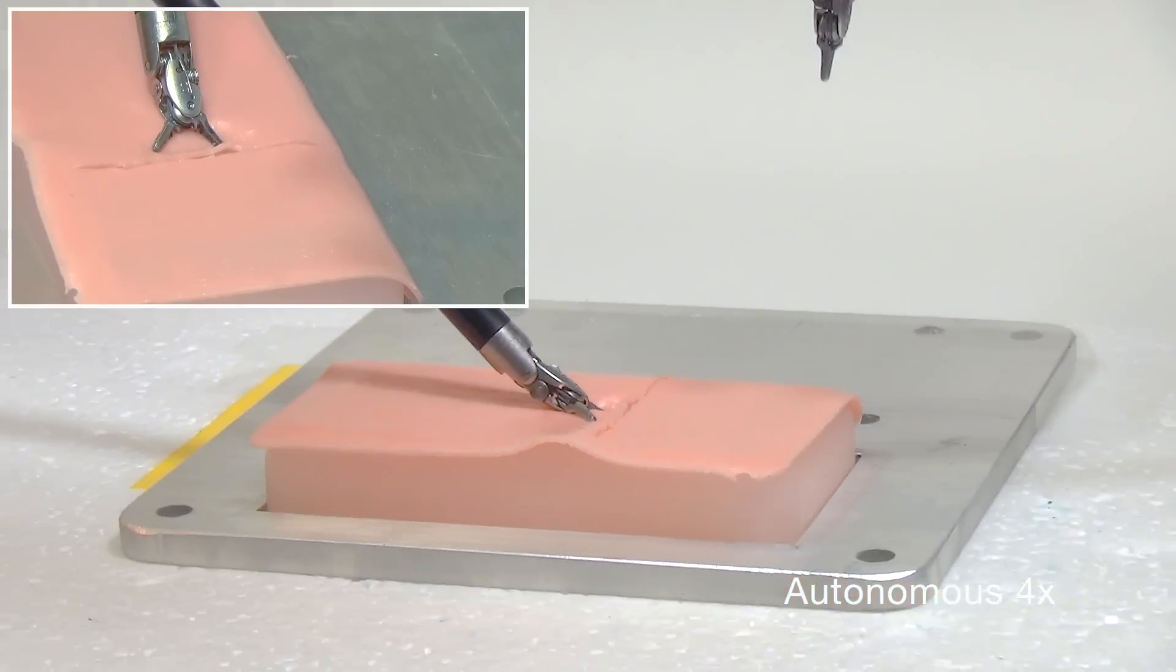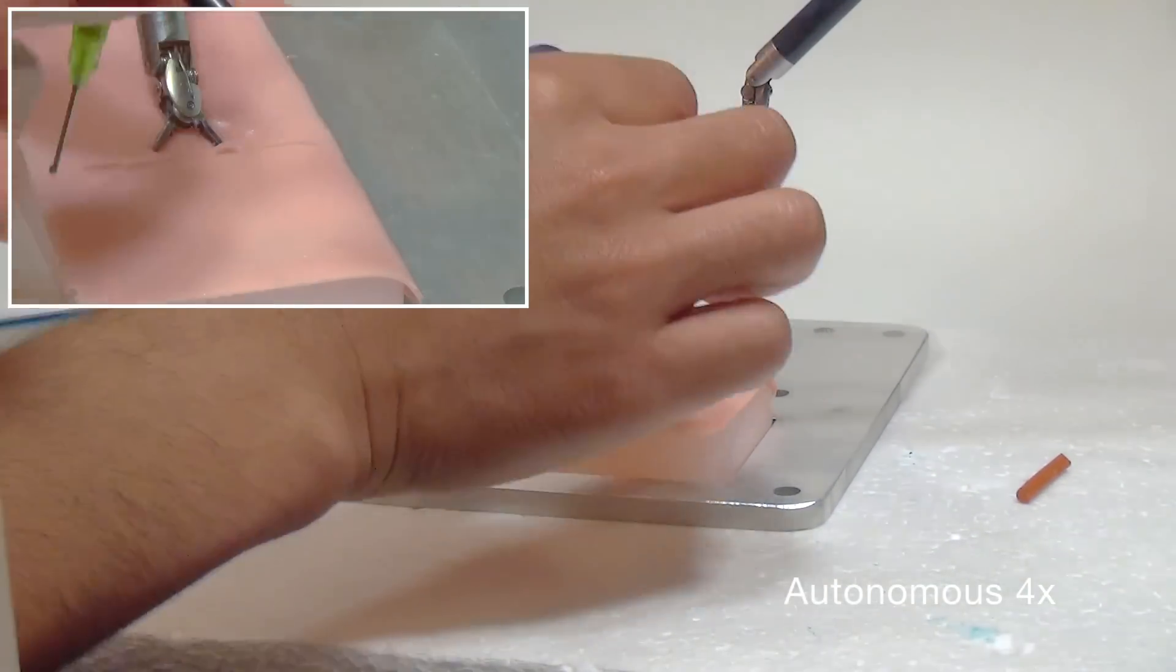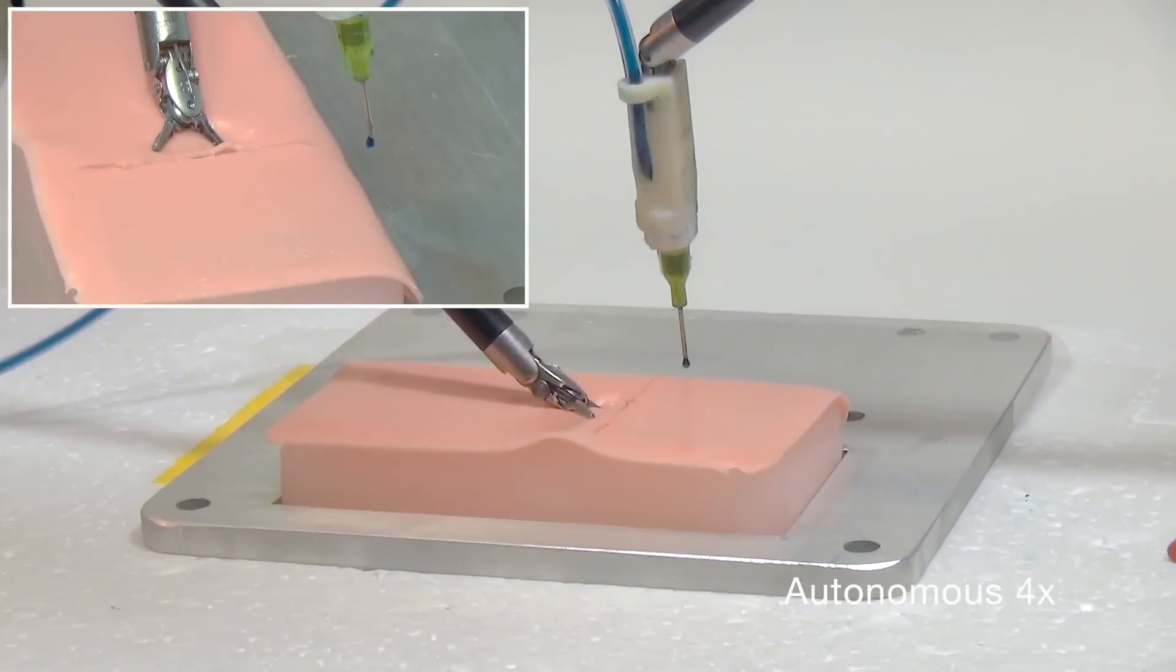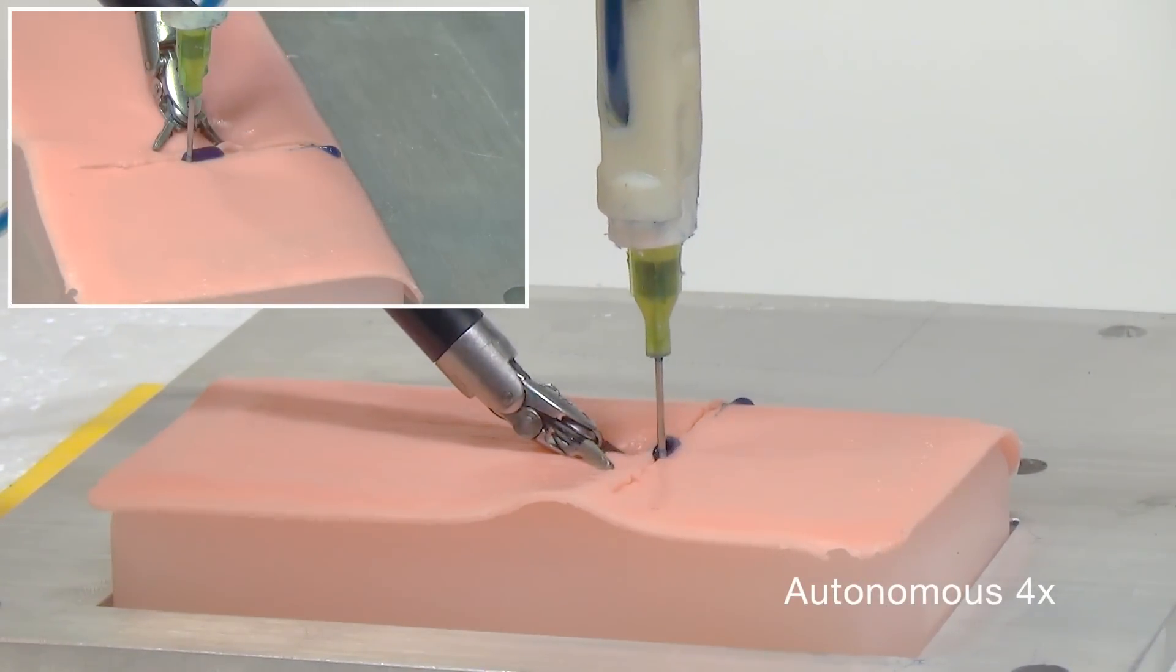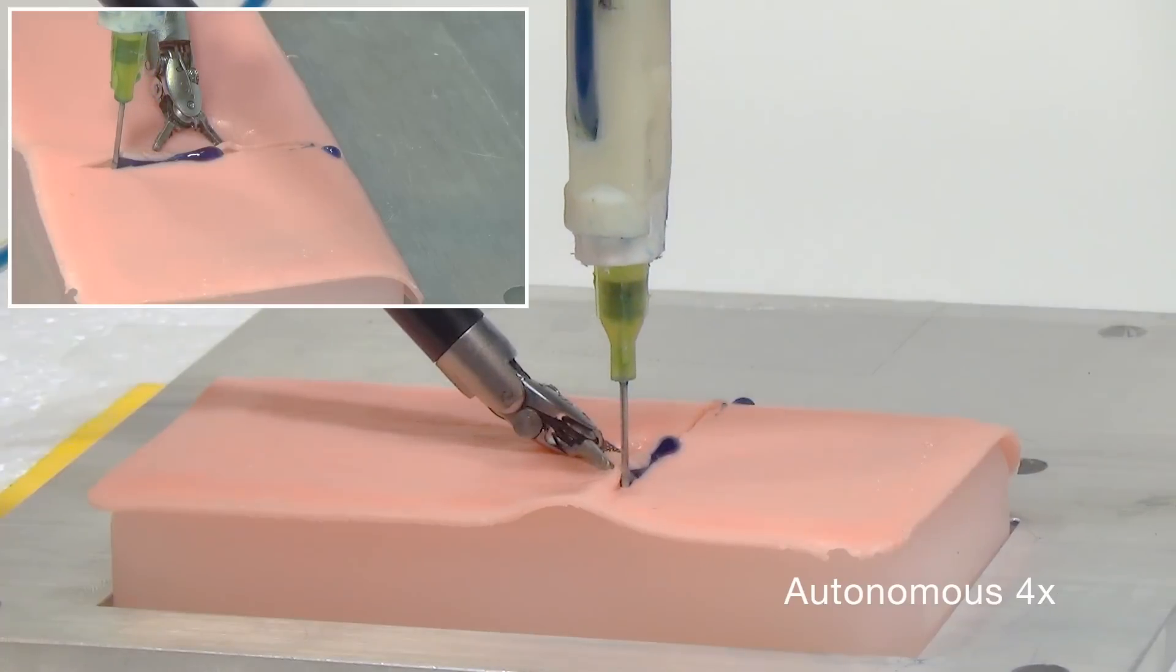The final step is the closure of the incision wound using surgical adhesive. One arm stabilizes the incision, while the other uses an automated injector we designed and implemented to apply the adhesive at a constant rate.